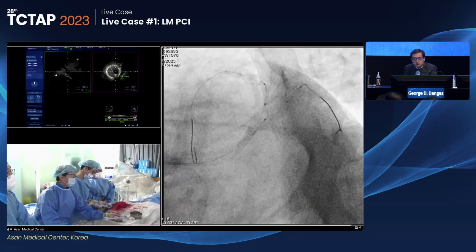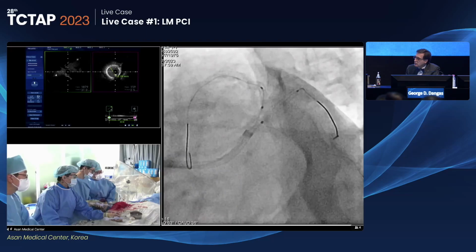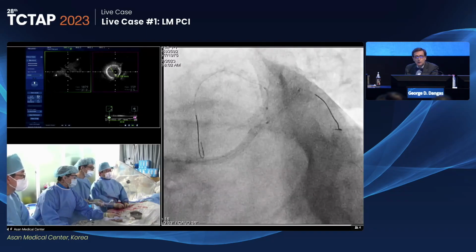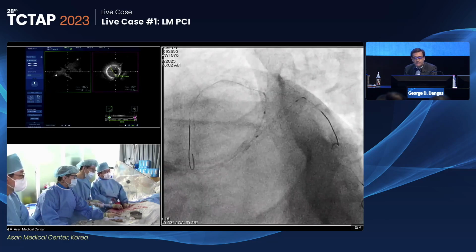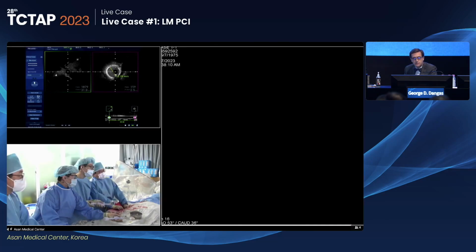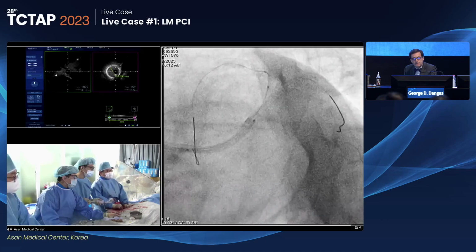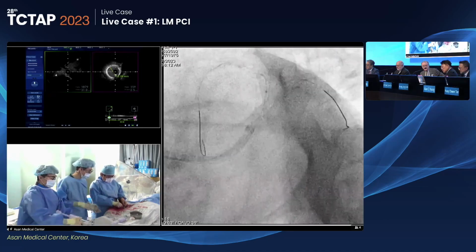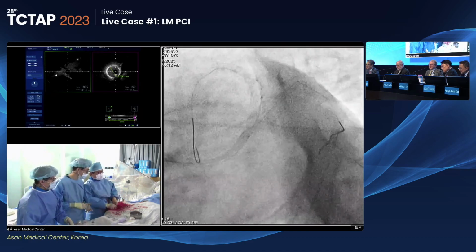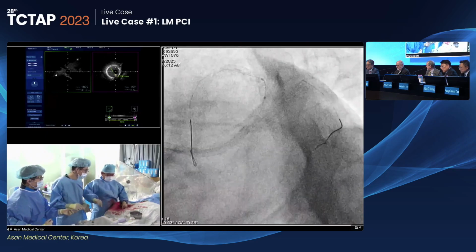Sure, but once you put a stent in, you can't take it out. Why do we need to take it out? Stent or no stent, we can always bypass distally. The stent doesn't do any harm here. Surely we're not setting out to do a bypass operation. Well, in 10 years from now, he may have one. He's only 48. But I don't think this will last. Why do you do it now as if you were thinking about bypass? I'm not thinking about bypass, but it's a backup option. You want to waste resources? You do PCI, you do bypass.